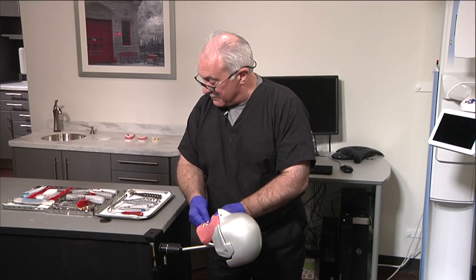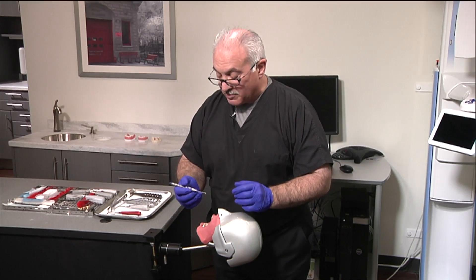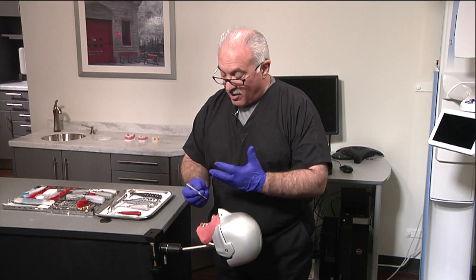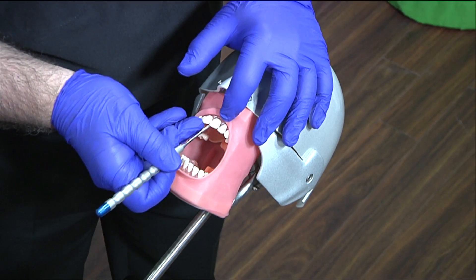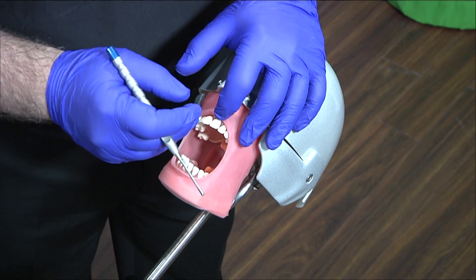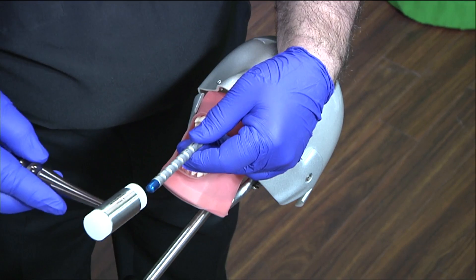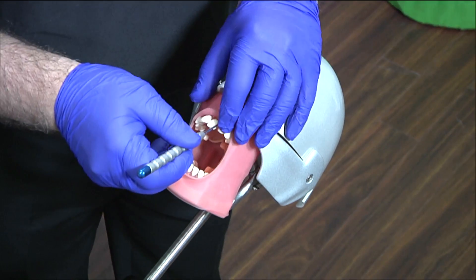Another instrument that comes in handy — these are the hybrid luxator periotomes, called luxotomes. This one happens to be an exotome. The design of the handle fits perfectly to my tactile senses; it has an indentation right where my finger pads are. All the other companies use the same tips — the handles differ. So you can circumferentially do the same thing with a finger rest. This also comes in handy when tooth number nine is broken down to the gingiva and it's dense bone and nothing's moving. You can insert this into the PDL space, and your assistant helps you, then use a nylon-tipped hand mallet and gently tap to seat it, then apply more apical forces.